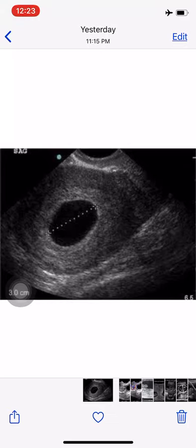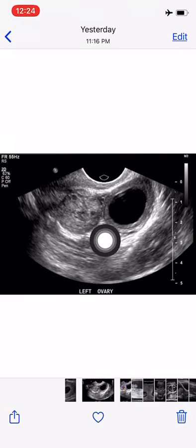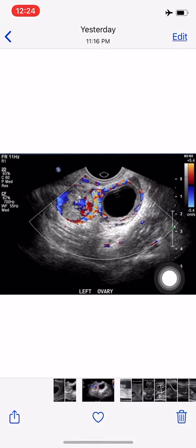هذا نشوف هنا هو gestational sac which is empty, no fetal pole. This is blighted ovum which is an unviable pregnancy. The other point here, detection of ectopic pregnancy. Ectopic pregnancy عادة تصير thick wall cystic mass beside the ovary. This is the ovary, and this is thick wall cystic mass. طبعا إذا بالدوبلر راح نشوف peripheral vascularity. This is example of ectopic pregnancy.